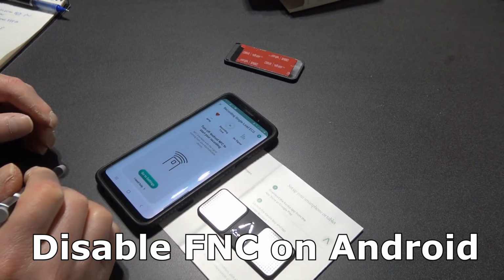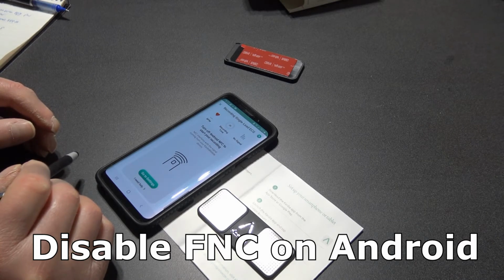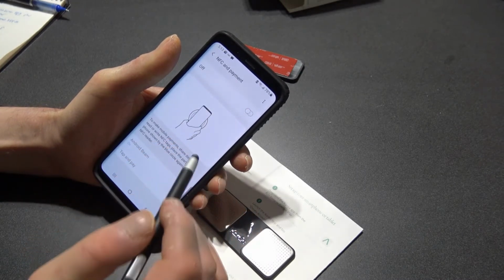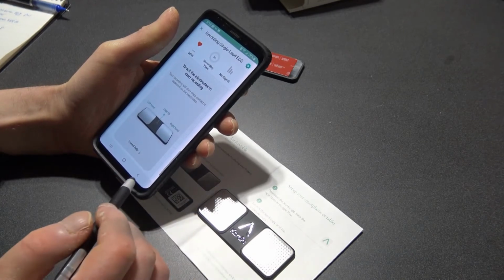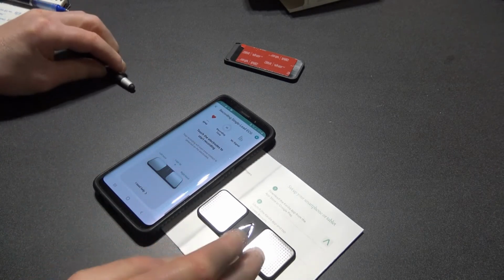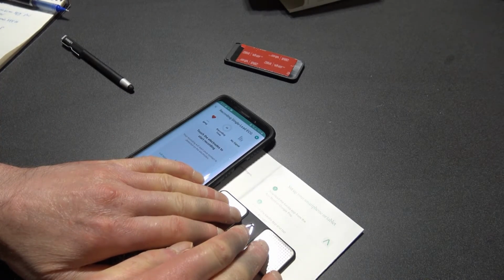Turn off Android NFC to start recording. NFC interferes with the signal coming from your KardiaMobile device. Yeah, it's actually simple. All you have to do is turn off NFC and payment. And the recording will start once it's connected to the electrode. So let's give this a try. I have poor circulation in my fingers, so this may be a problem.